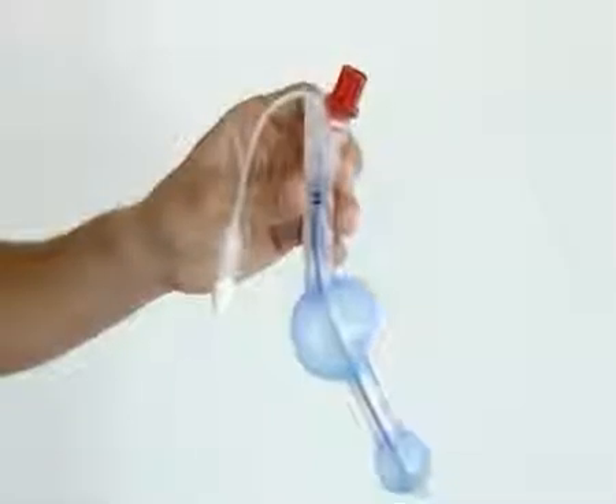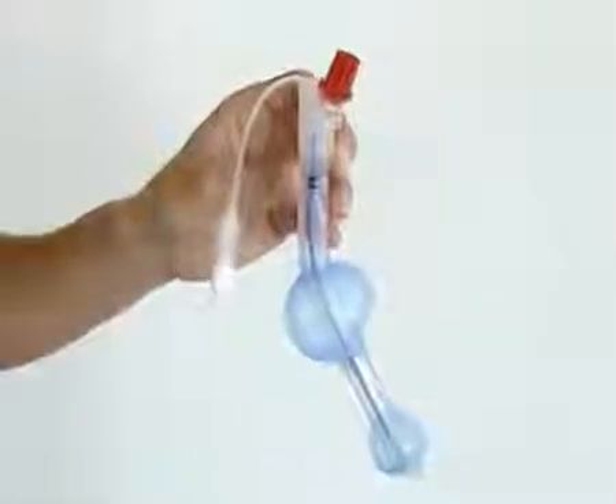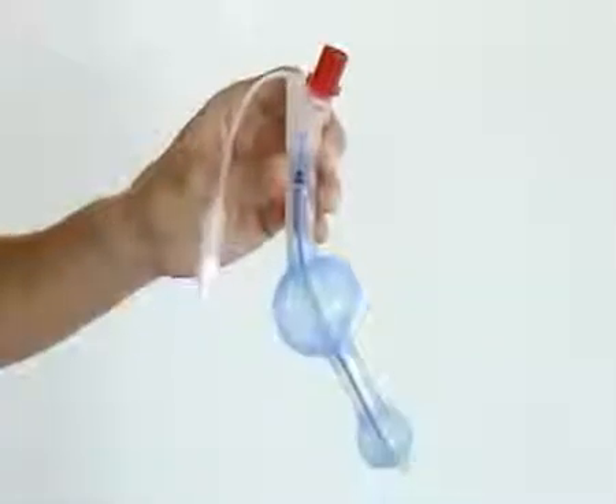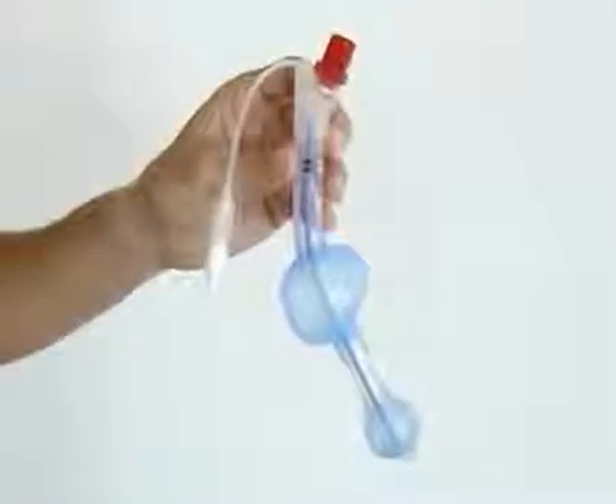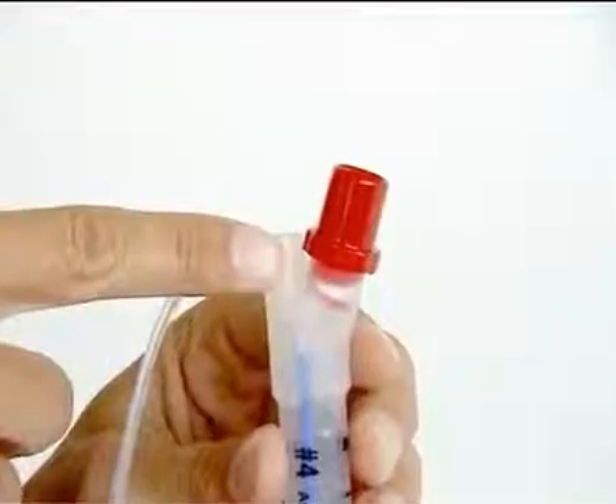The VBM laryngeal tube LTS has been developed for pre-hospital and clinical airway management. As a stage of development to the LT, the new LTS separates the respiratory from the alimentary tract.